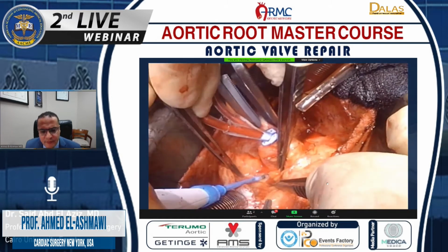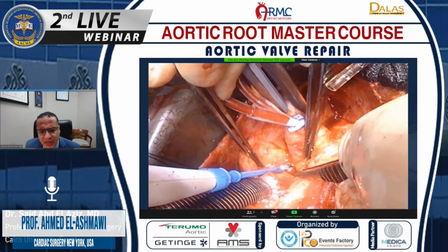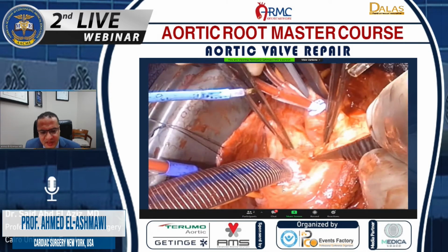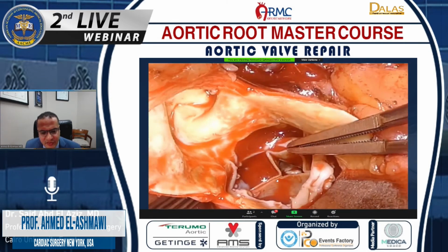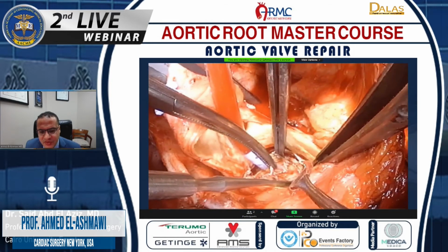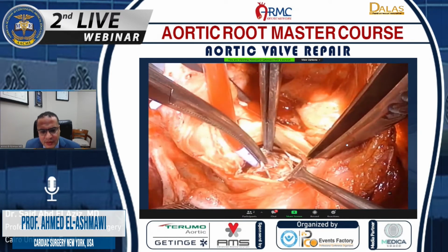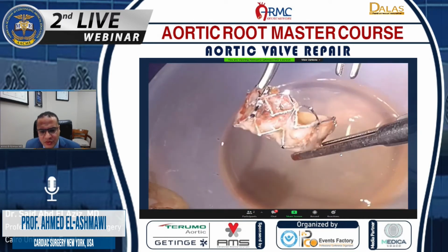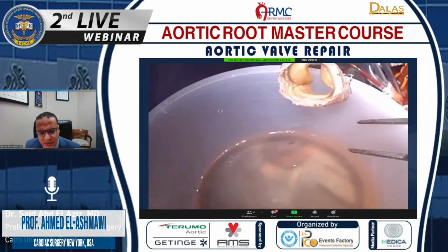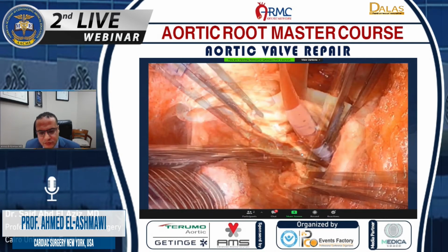Here we did the re-op sternotomy. We dissected the dome of the left atrium, and we did an oblique, very generous aortotomy that goes vertically toward the TAVR valve, which was taken out of the left ventricular outflow very easily without any issues. We resected the aortic valve and did debridement of the aortic root. We took out all the calcified leaflet. Then we cut across the aortic annulus, the non-coronary sinus, toward the dome of the left atrium.